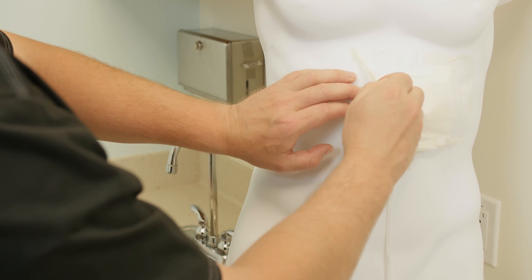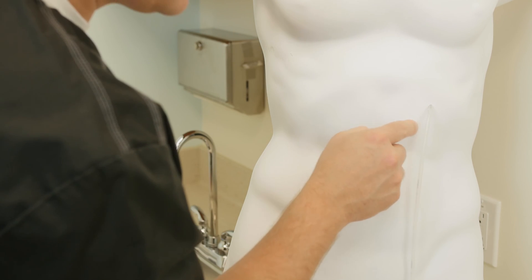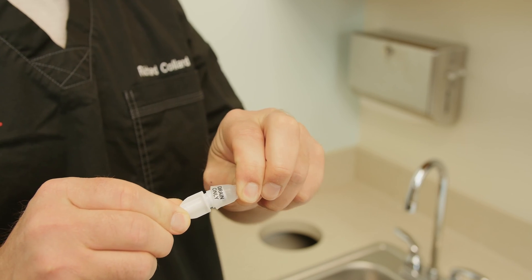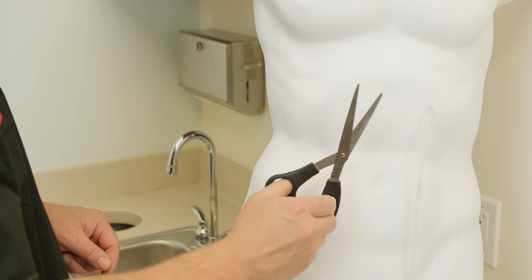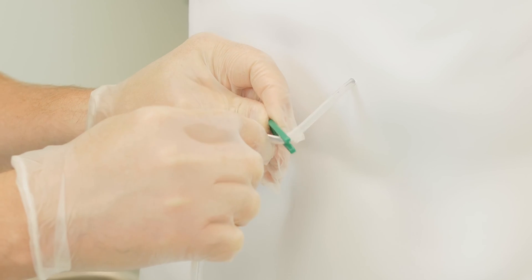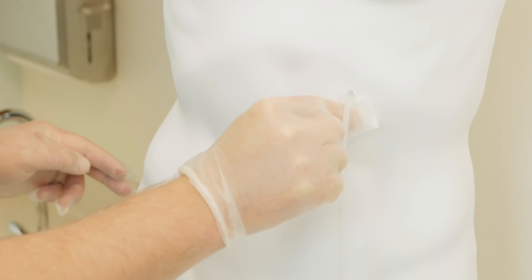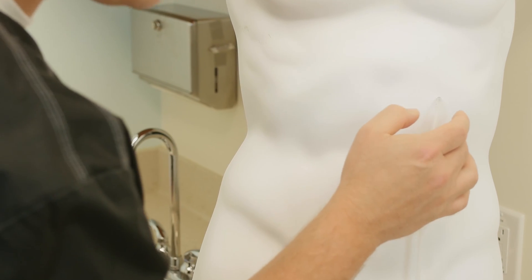At this point, it is time to change the dressing as instructed by your healthcare provider. You will need to carefully remove and throw away the clear dressing, gauze, and split pad. You should also do this if the gauze beneath the clear dressing becomes moist. Now, remove and discard the catheter valve cap from the catheter valve. Do not use scissors or any sharp objects that may damage the catheter. If the catheter is damaged, place the green emergency slide clamp between the catheter damage and the exit site and contact your healthcare provider. If you are changing the dressing, look at the exit site and skin around it. If you notice anything odd — such as redness, swelling, or oozing at the exit site — finish the drainage procedure and then call your healthcare provider.